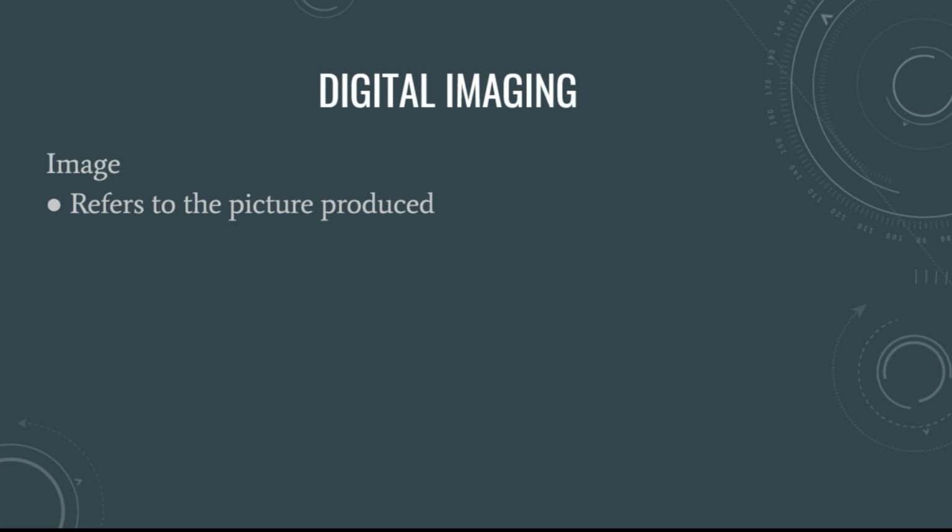An image refers to the picture produced. So once you've taken the X-ray and it's converted to all the little electronic pieces and appears on the screen, it's now an image.